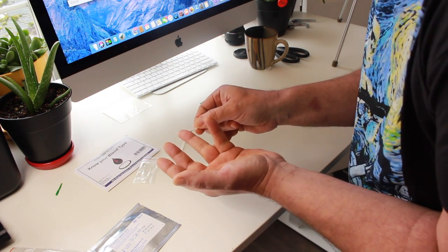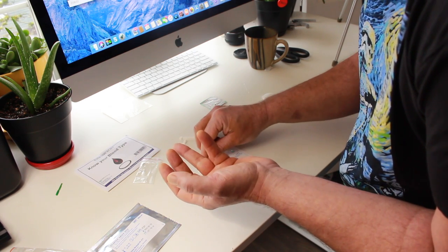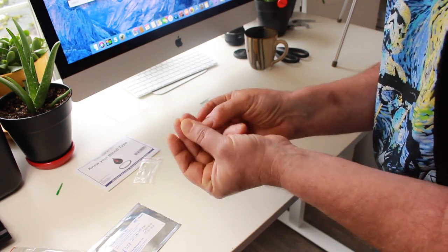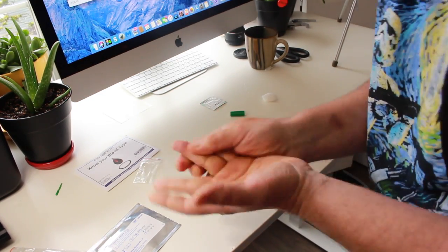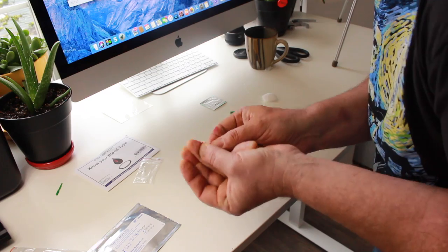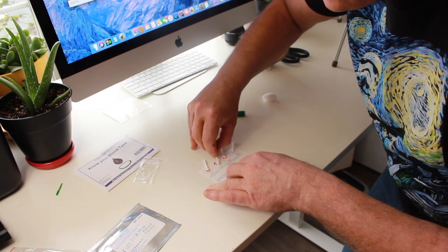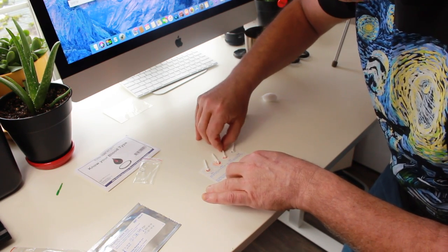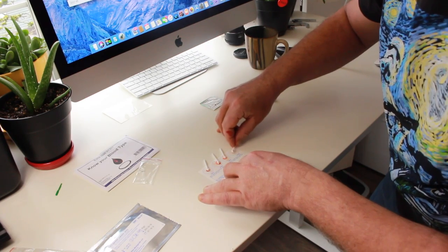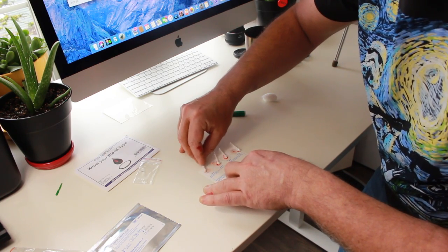Then you take one of these sticks, and you wipe as much blood on there as you can. Get the blood on. Seen a reaction.